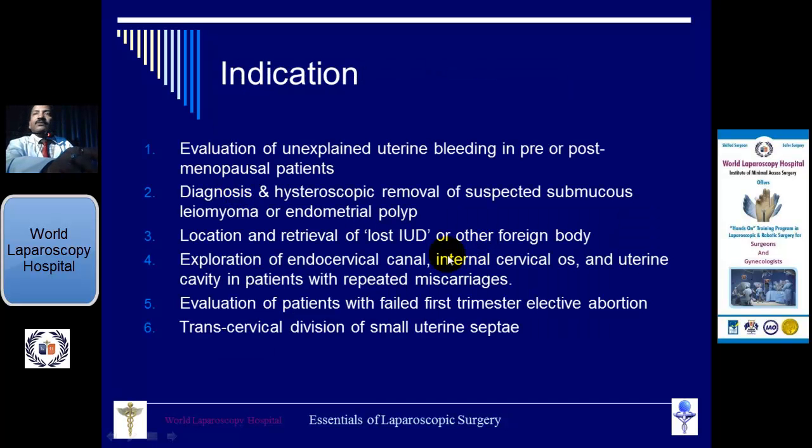Indication: once you start doing hysteroscopy, you can use it anytime. Sometimes the gynecologists are so fond of doing hysteroscopy that they routinely perform it before any hysterectomy also. If you have to do a hysterectomy, you can do one hysteroscopy before, so that in cases of malignancy and all, at least you can take the endometrial biopsy. So it's becoming an office routine setup, and you can do it in the multipara very easily.